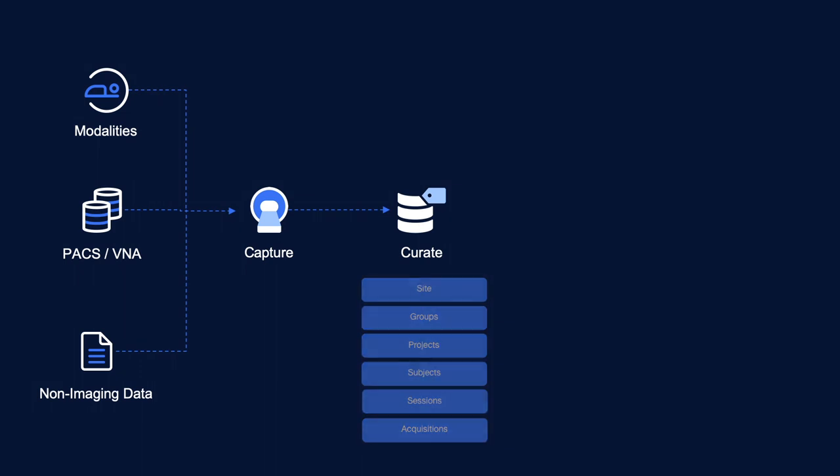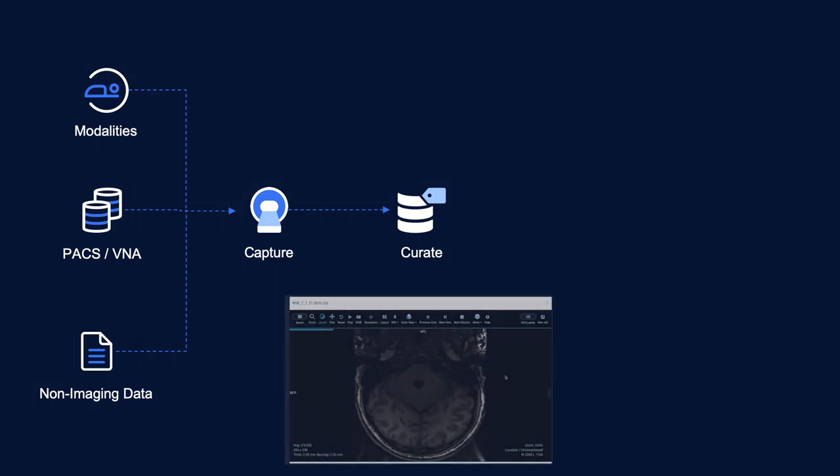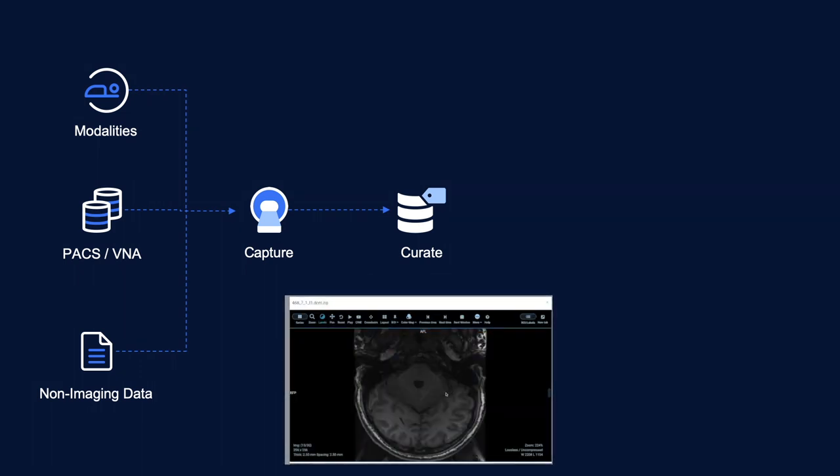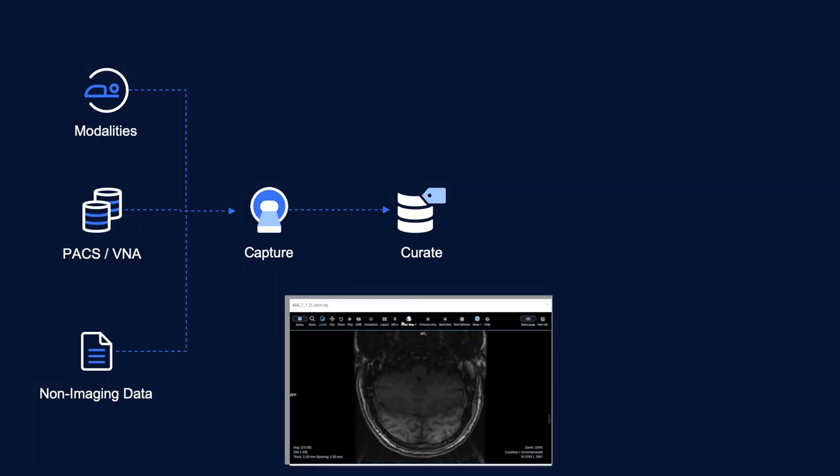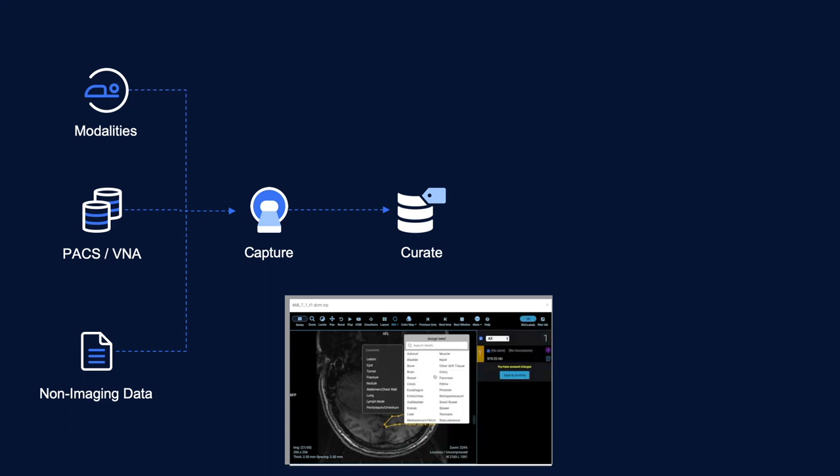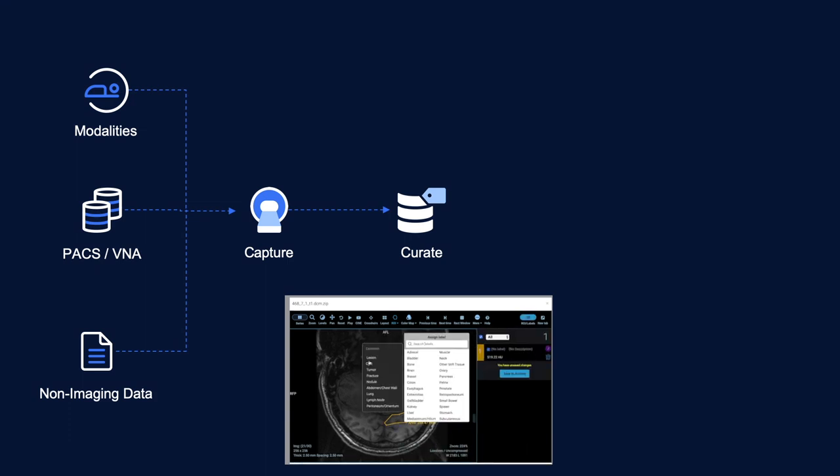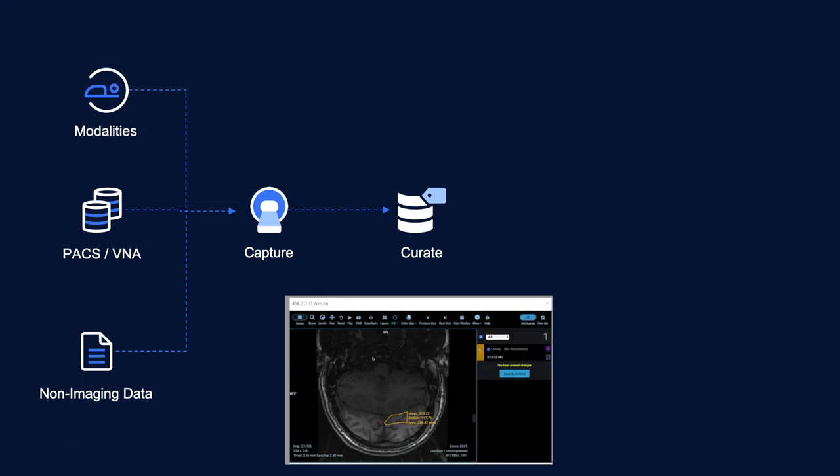Once your data arrives in your Flywheel project, you can quickly load an image into our viewer for visual inspection. Our viewer also includes annotation and labeling tools. These annotations are stored as custom metadata, which, like all your metadata, is indexed and immediately available to our powerful search tools.